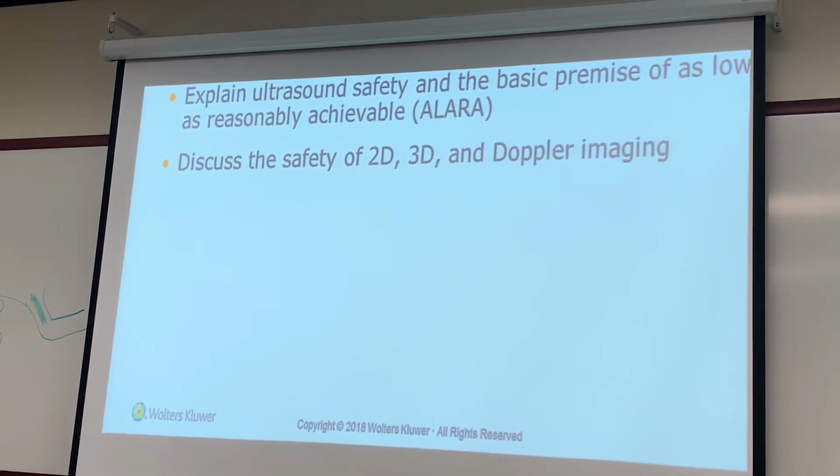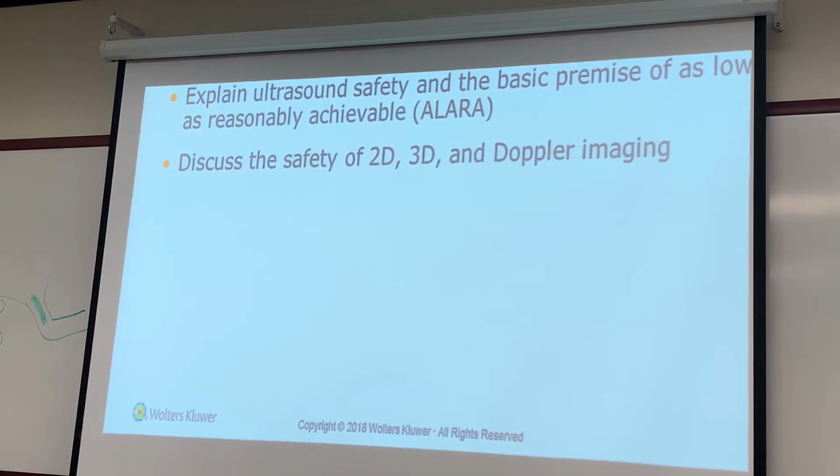Now what we teach you and what we have in the lab is 2D. They even have 3D and they have 4D. 4D is absolutely amazing. You can actually see the pores on the face. Basically, it's a reconstruction of the plane that you're in, where it sees all the way around it.